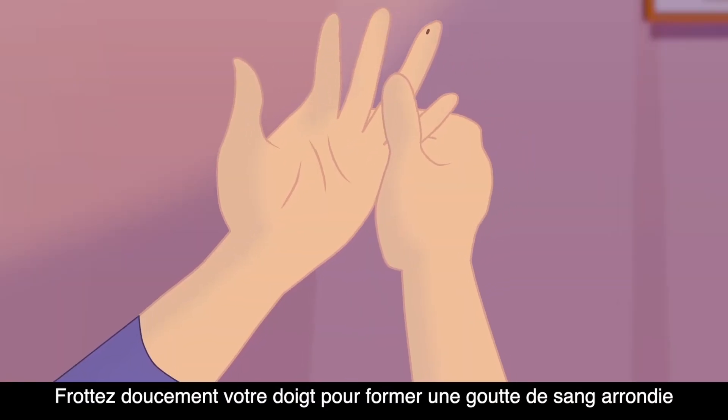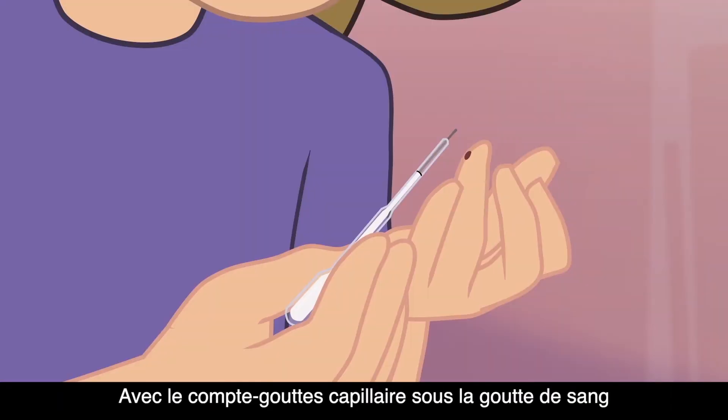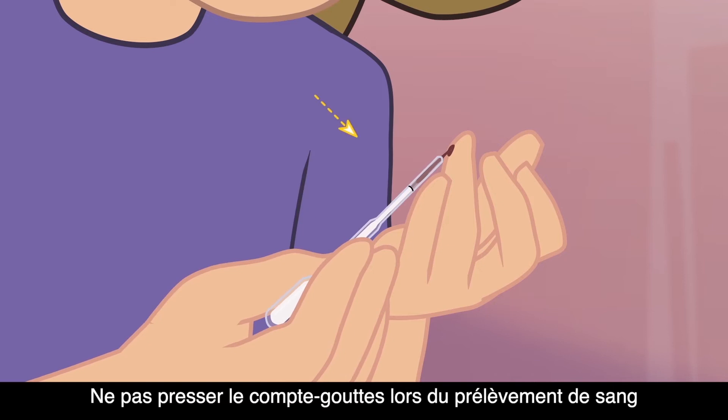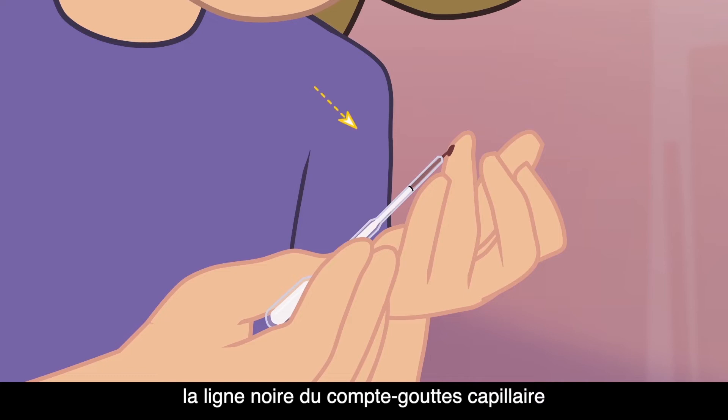Gently rub your finger to form a rounded drop of blood over the puncture site. With the capillary dropper below the drop of blood, touch the end of the dropper to the blood. Do not squeeze the dropper when drawing blood. You may repeat these steps until blood reaches the black line of the capillary dropper.